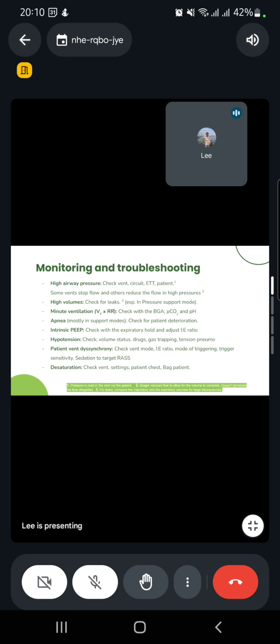Now, high volumes, you need to check for leaks, especially now in the pressure support mode. This is when you're weaning off, like Dr. Faith has said.